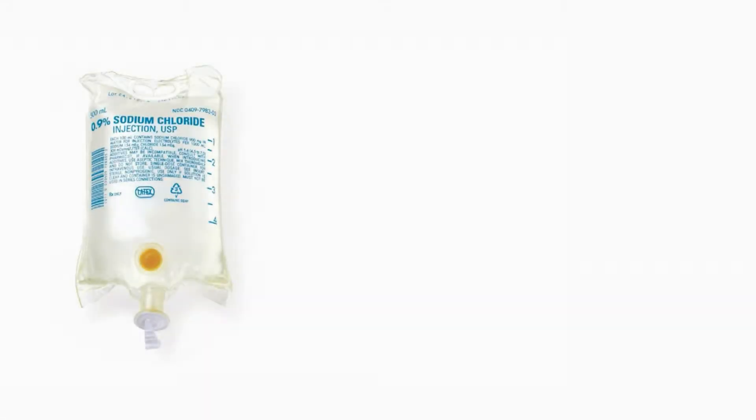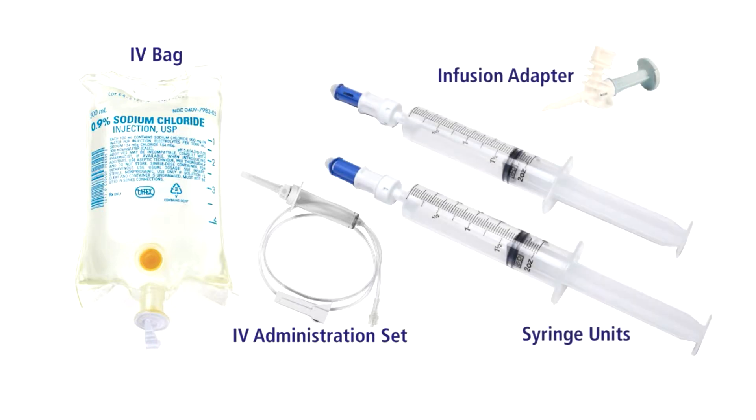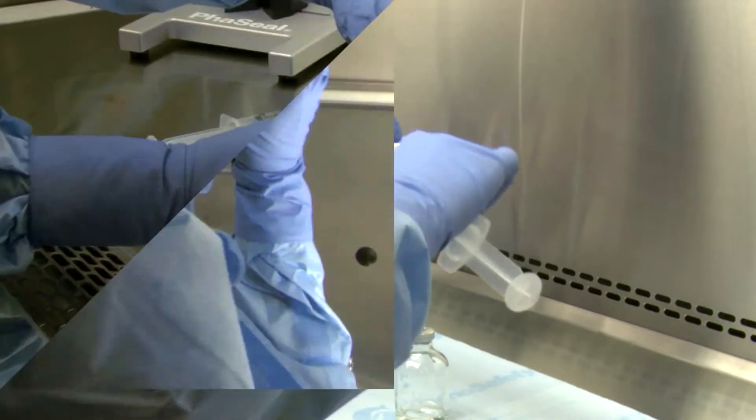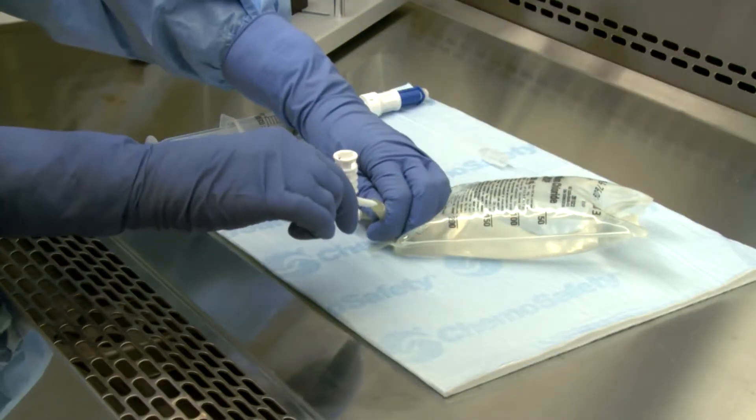To prepare an IV bag using the BD-Facile infusion adapter, you'll need an IV bag and administration set if priming the line in pharmacy, plus a BD-Facile infusion adapter and one or more prepared BD-Facile syringe units. On a flat surface, spike the IV bag with the BD-Facile infusion adapter.